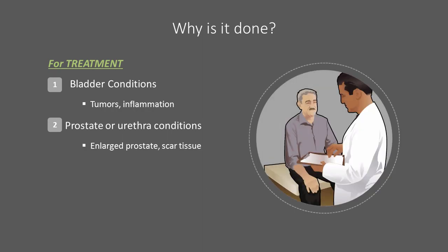Conditions that may be treated with the assistance of cystoscopy include bladder conditions, such as tumors or various types of inflammation, and prostate or urethral conditions, such as an enlarged prostate or scar tissue in the urethra.